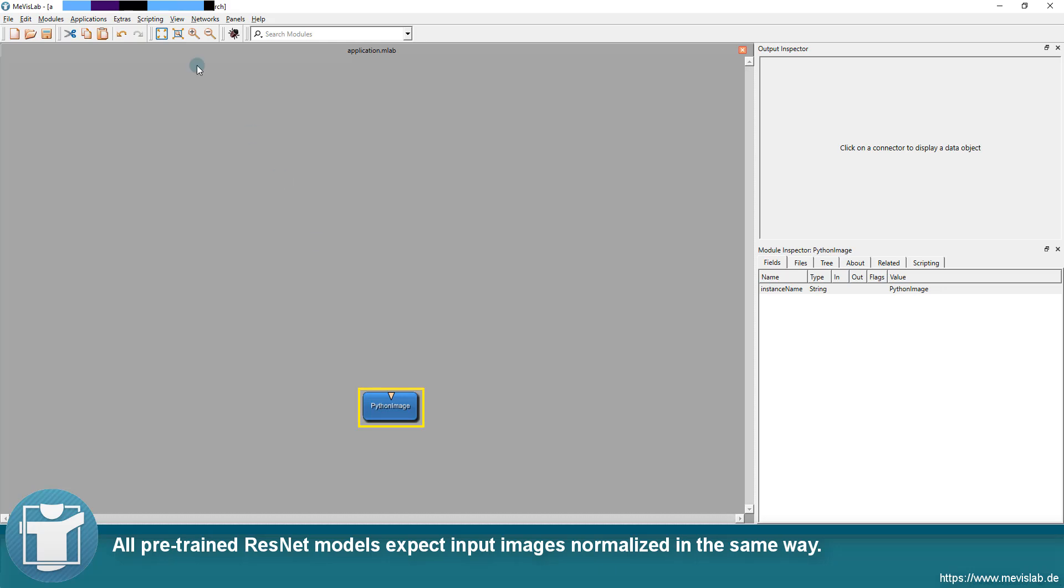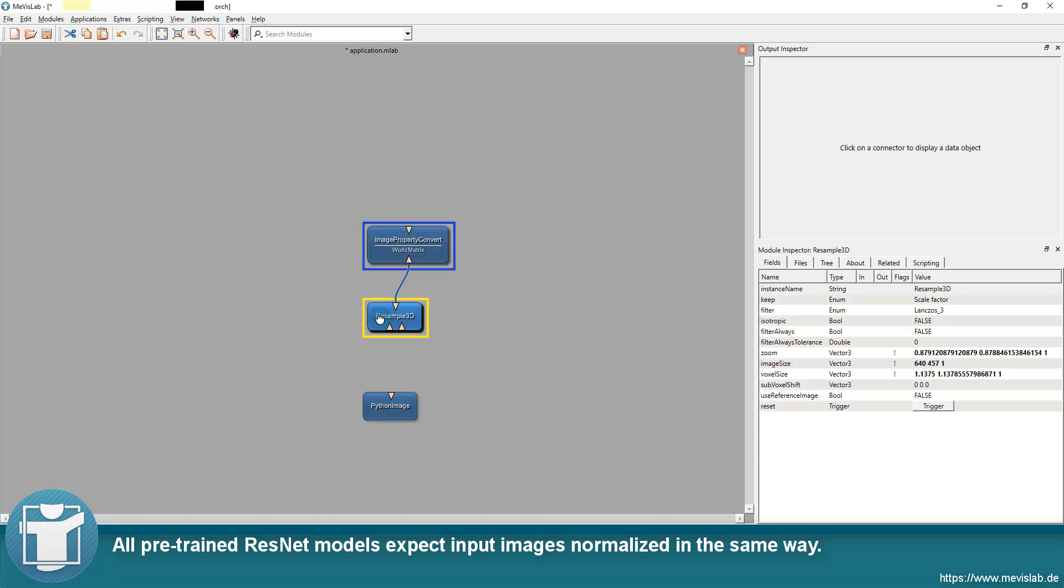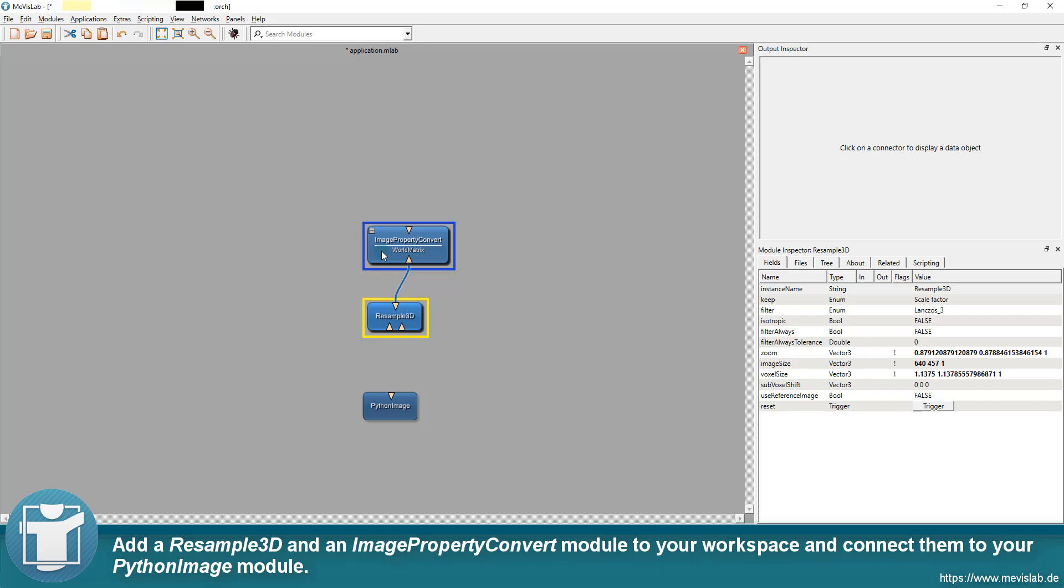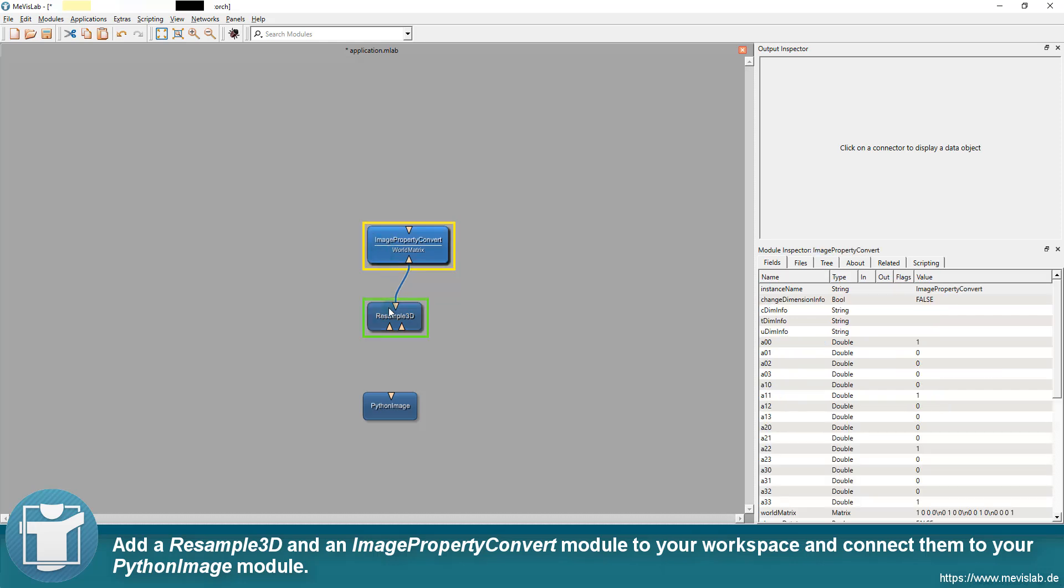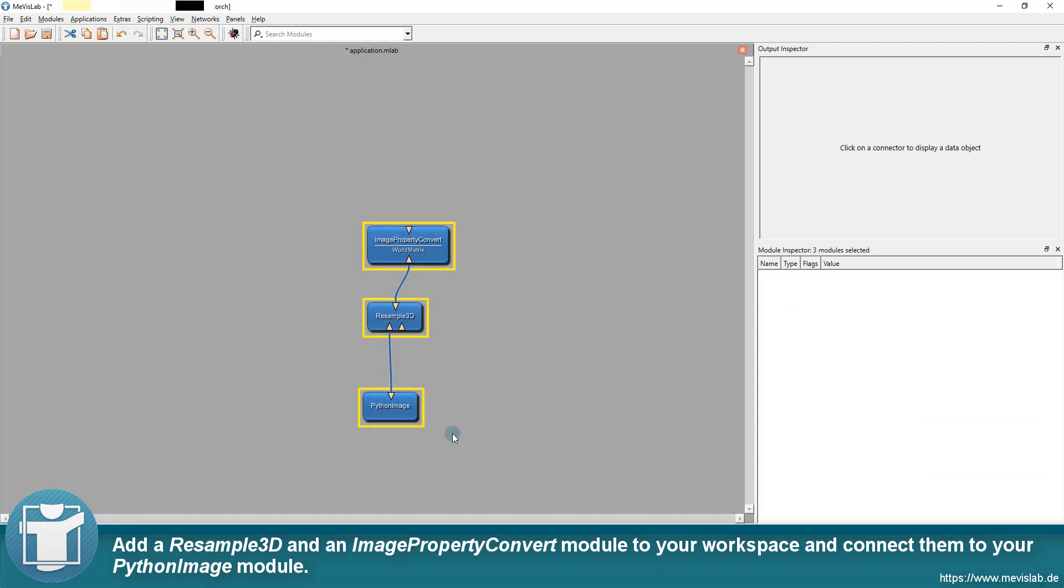All pre-trained ResNet models expect input images normalized in the same way. Add a resample 3D and an image property convert module to your workspace and connect them to your Python image module.